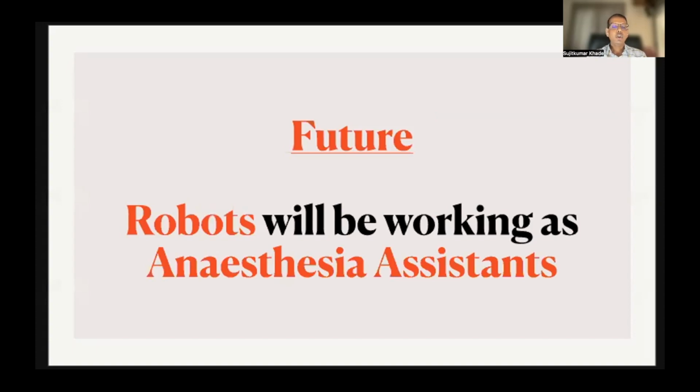Please choose a tidal volume of 420 ml and adjust respiratory rate to maintain end-tidal carbon dioxide of 32 millimeters of mercury, which I do regularly. Let's provide preemptive analgesia using usual doses of tramadol and paracetamol. And in future, definitely robots will answer, sure, we'll do that for you, Sujit. Then robots will request me, keep informed about the surgical progress. And I will reply, yes, very happily. So this was the future I pursue. Thank you.